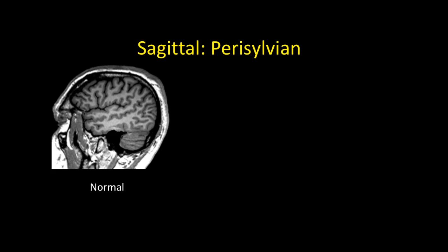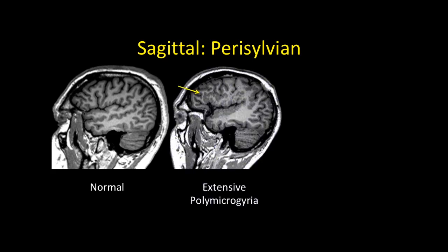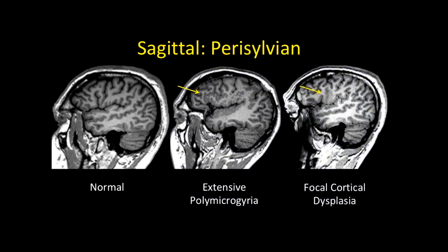After clearing the midline, we go to the perisylvian on both sides of the brain. Here's a normal image for comparison, here's a case of extensive polymicrogyria, and here's a subtle cortical dysplasia. I've found that locations where the brain folds on itself — like the interhemispheric fissure or the sylvian fissures — tend to be good areas to find seizure foci.